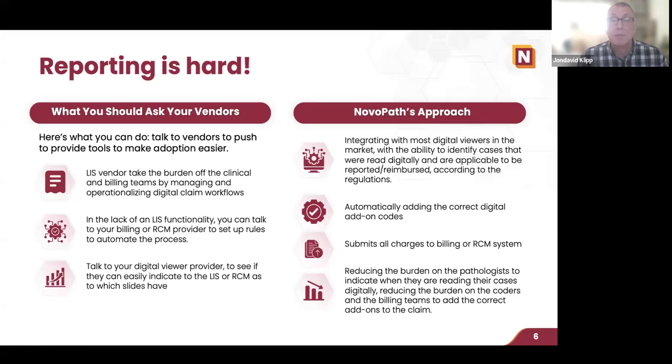I mean, there are labs today investing in digital pathology, investing in the scanners, the employees, the software systems, the storage of the images, and what they are counting on is that there will be reimbursement, number one, in the future, and number two, the other return on investment for investing in digital pathology is the ability to run AI software tools on the images that you have digitized, which can speed and increase the number of slides that a pathologist can read every day.